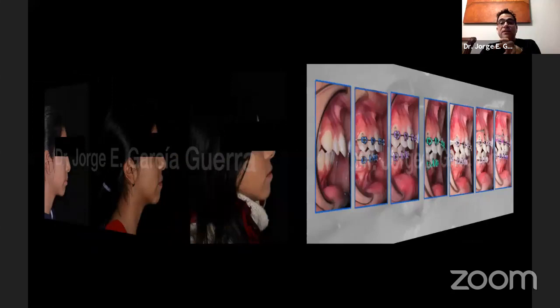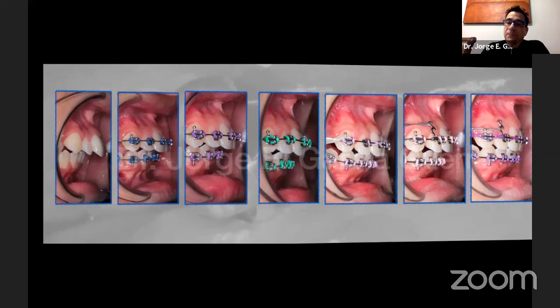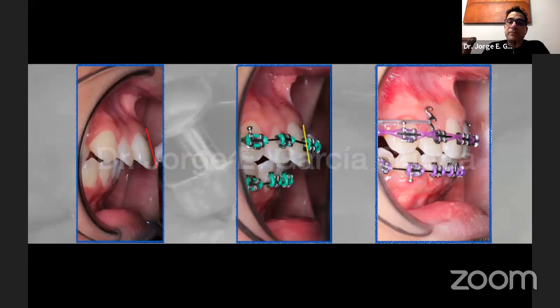Now here we have the sequence, how we were with the overjet, how we had a lot of protrusion at the beginning, so we were closing the spaces. In some of the pictures, you can see that we did some bracket rebonding, or we rebonded a lot of bracket positions. So this is the progression of the treatment. We're trying to maintain the angulation of the incisors so that we don't have an excess overbite.